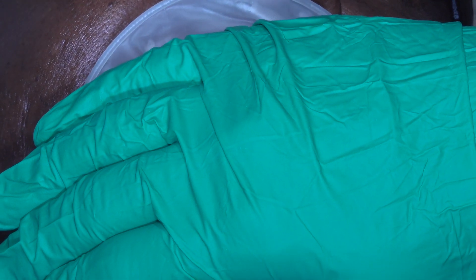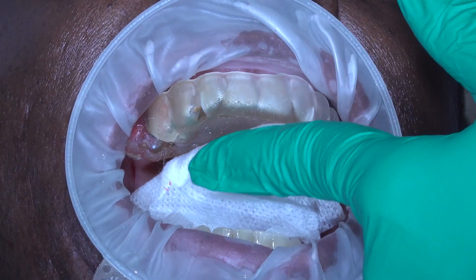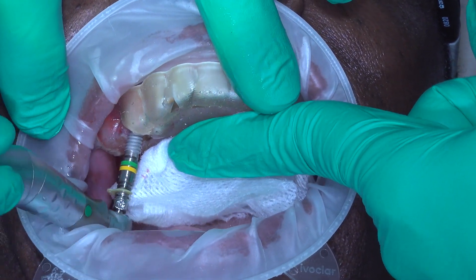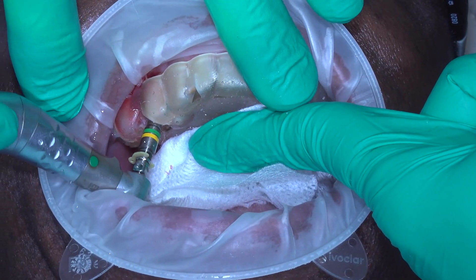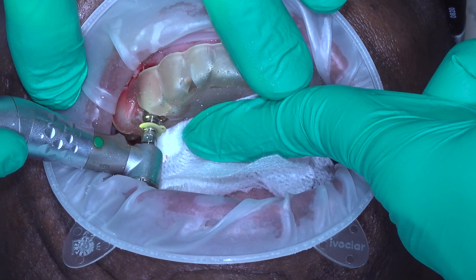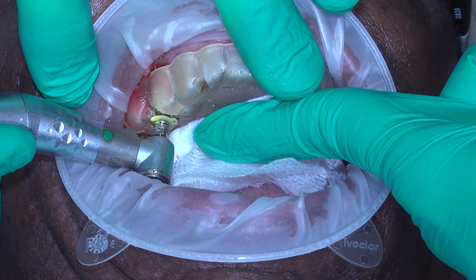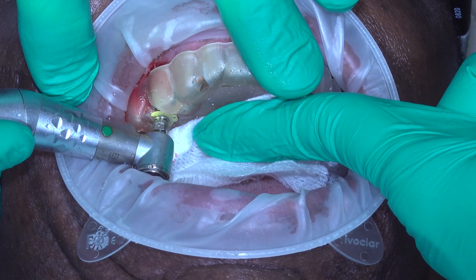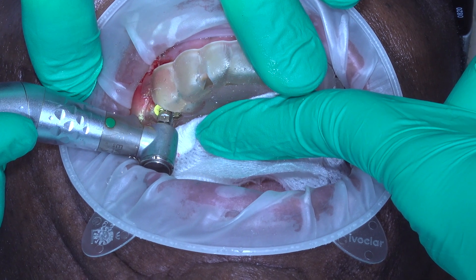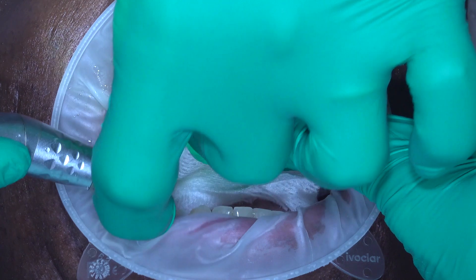Notice my assistant's covering the mouth. Before we go into the mouth with any small objects, we want to make sure we have a throat screen in place. She was grabbing the throat screen with her other hand. We go into the back of the mouth with the head of the instrument and bring the implant and driver to the front. We're going to drive it until that little plastic snap link touches the top of the master cylinder — that's the metal piece inside the guide. Right here, our motor torques out.